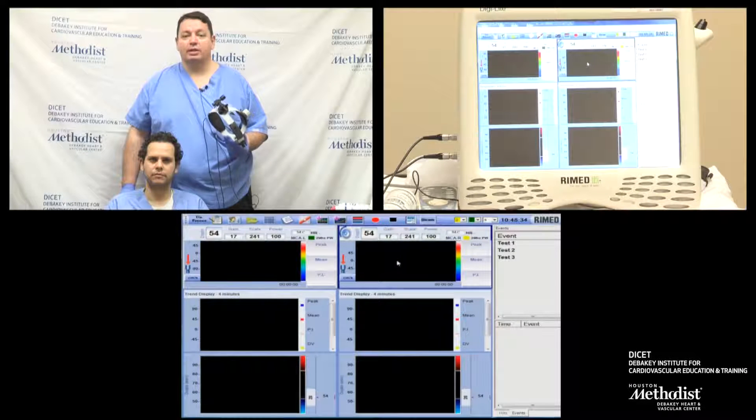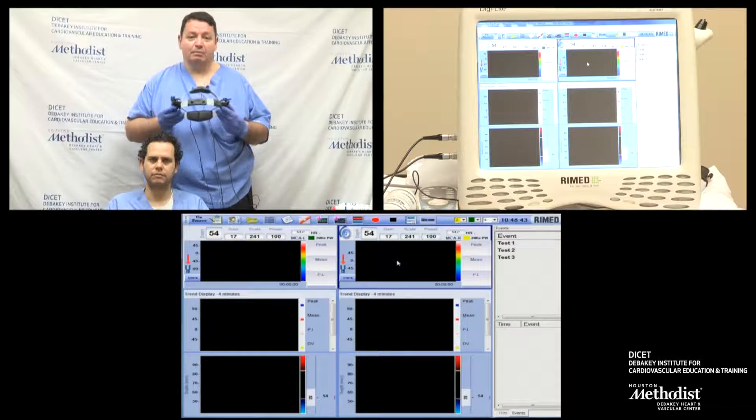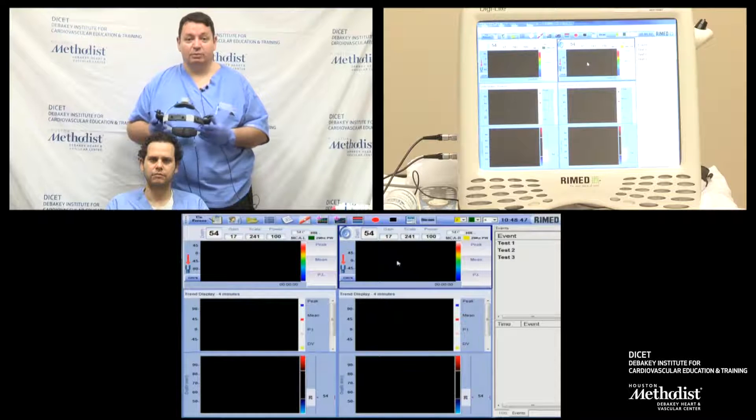Welcome back to our ultrasound training seminar. Today we're going to demonstrate Transcranial Doppler Monitoring and place a headframe on our patient. My name is Joel Garami. I'm the Medical Director for the Vascular Ultrasound Lab here at Houston Methodist Hospital.